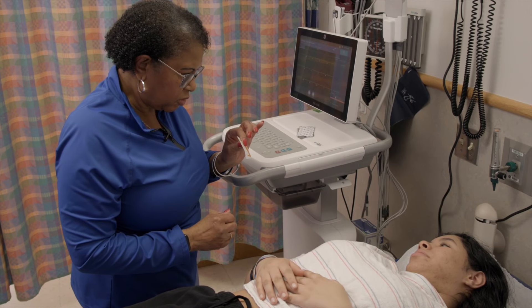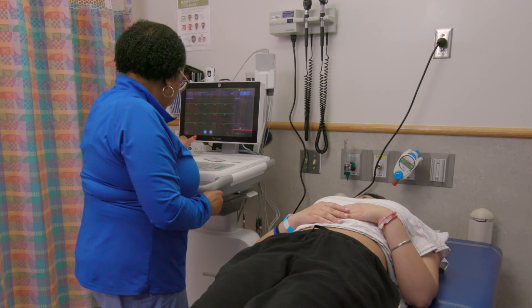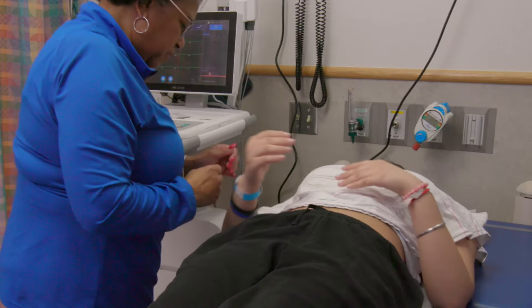This is a little alcohol. We're going to prep your skin with it, okay? And just relax your arms down by your side.